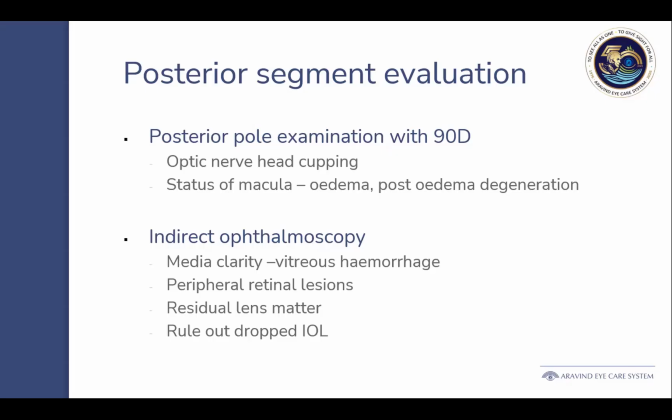Another thing is, if it does get into some litigation or something, more liable than the person who dropped it is the person who put an IOL without looking at that drop. Okay.